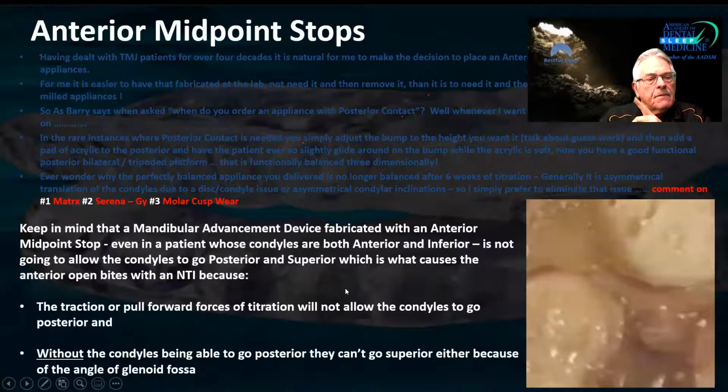So keep in mind that a mandibular advancement device fabricated with an anterior midpoint stop, even in a patient whose condyles are both anterior and inferior, is not going to allow the condyles to go posterior and superior, which is what causes the anterior open bites of the NTI appliance to begin with.